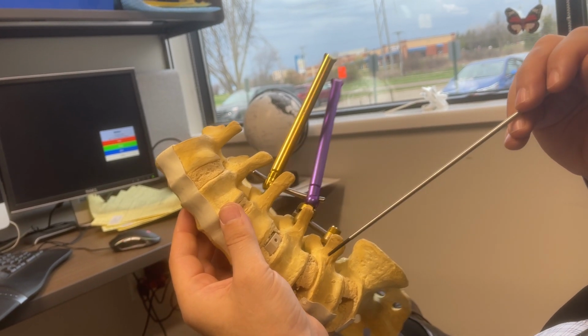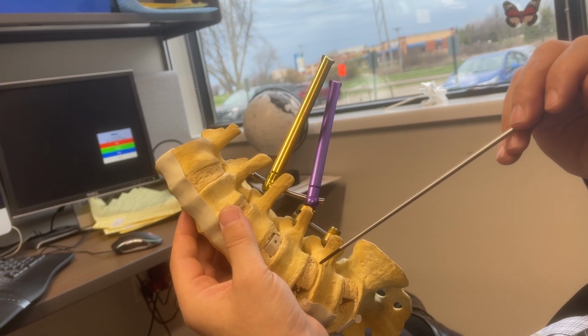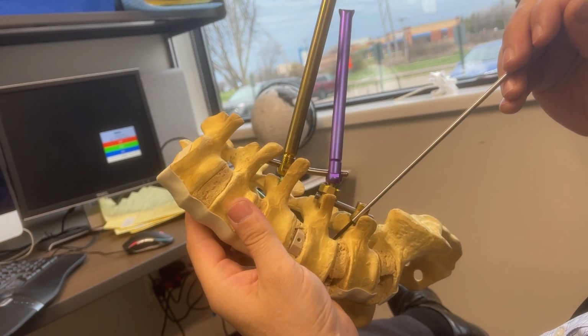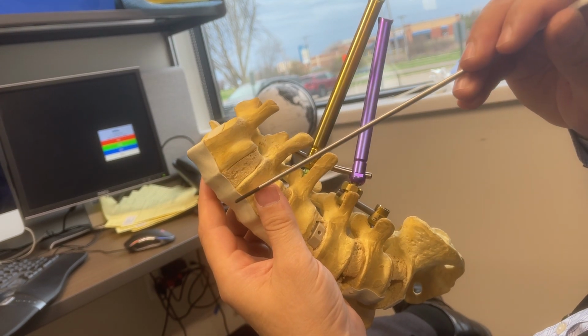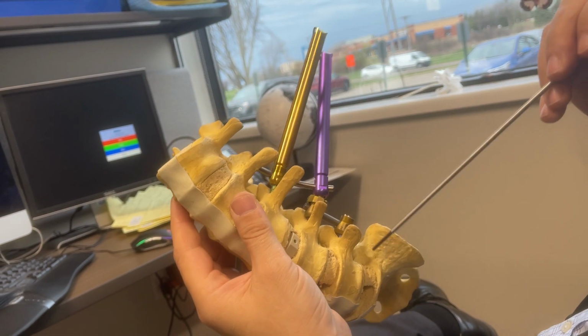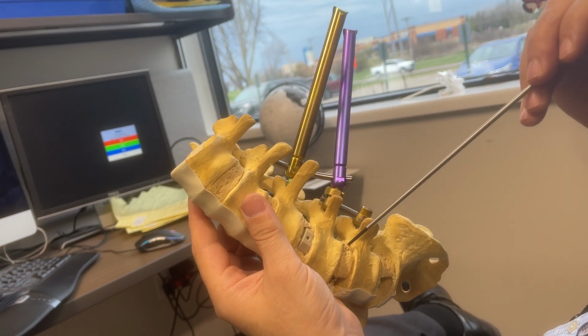The risk profile of our prone lateral or MIS DLIF is the same as the OLLIF, and that enables us not only to correct deformity much better, but also to use that technique at L4-5, L5-S1.